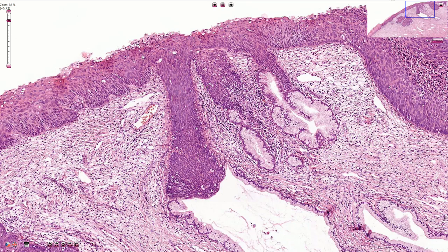The maturation is completely lost, and in this part of the slide we can see the infiltration of the endocervical glands. The basement membrane is still intact and this part of the epithelium is not associated with invasive growth.